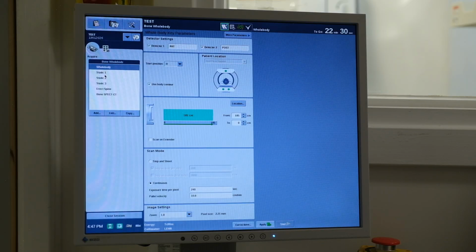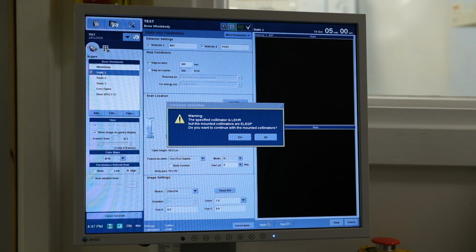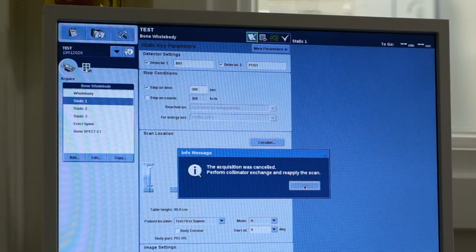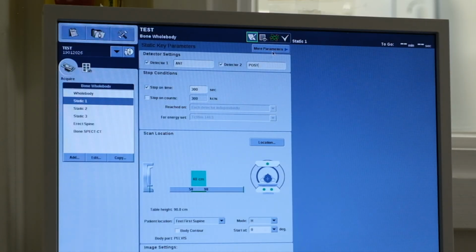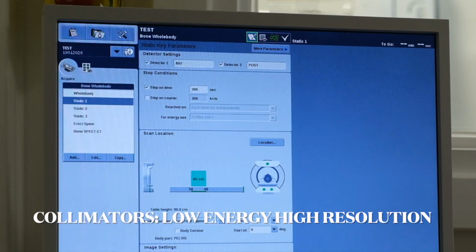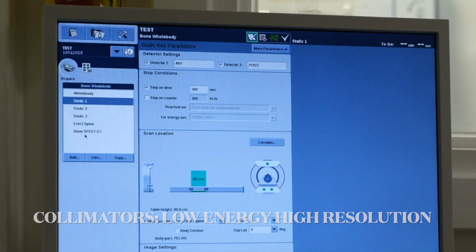In this department, most of the time we would acquire the whole body scan first and then review the images with the doctors, and then they may ask for additional pictures. So we have set up some static images, so if they wanted additional pictures, for example, oblique ribs or medial lateral knees, we can edit this information in order to acquire whichever statics we needed.